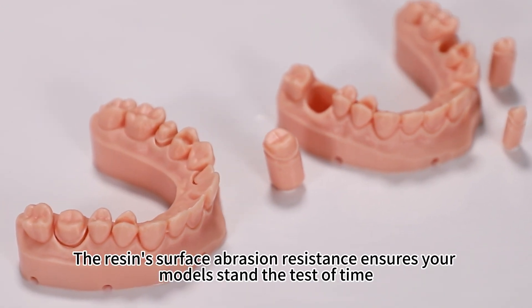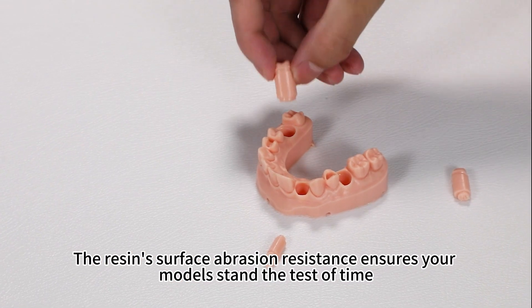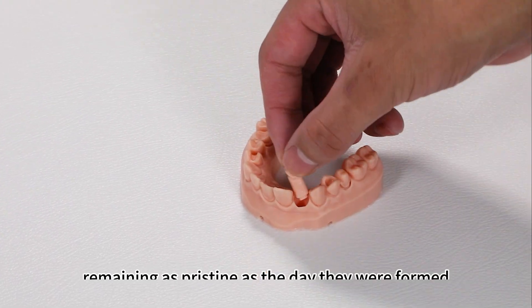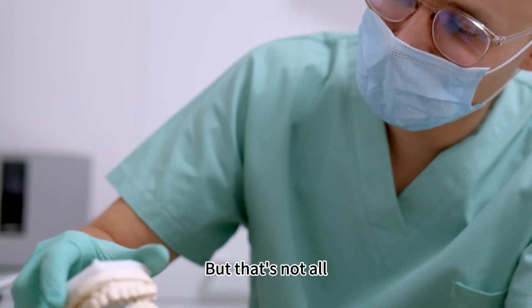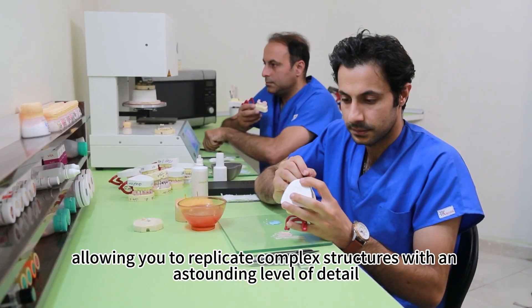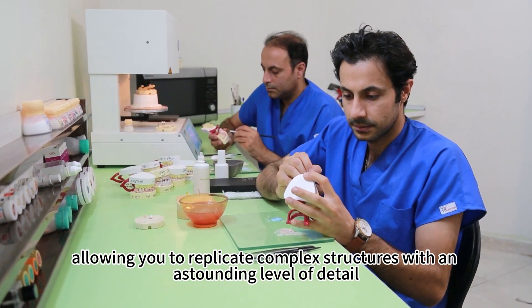The resin's surface abrasion resistance ensures your models stand the test of time, remaining as pristine as the day they were formed. But that's not all — our resin also delivers high detail reproduction, allowing you to replicate complex structures with an astounding level of detail.